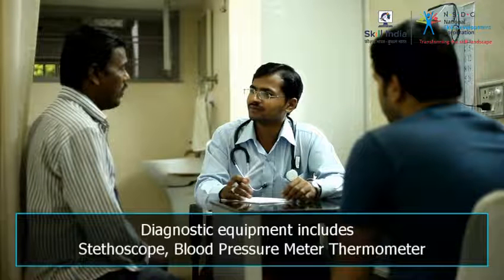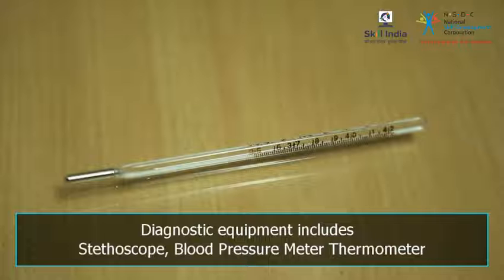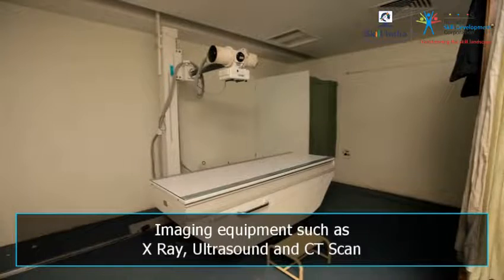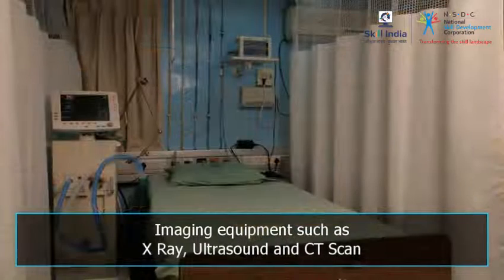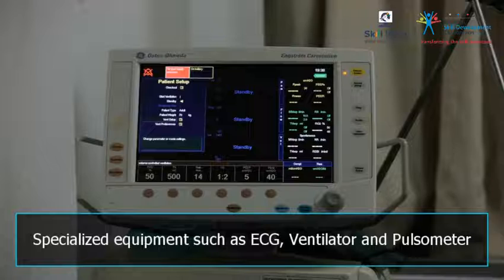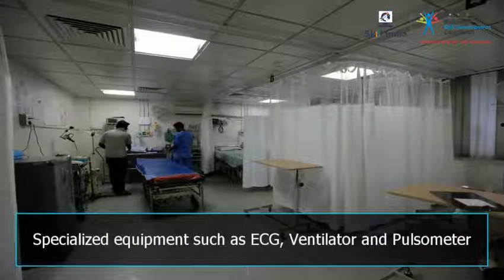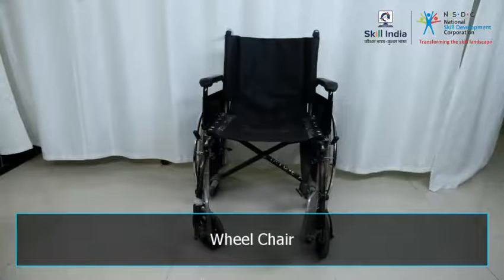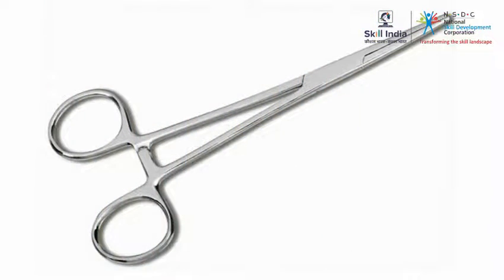The common medical equipment used in the hospital include diagnostic equipment that include stethoscope, blood pressure meter, thermometer, imaging equipment such as X-ray, ultrasound, CT scan, MRI, specialized equipment such as ECG, ventilator, oxygen pulsometer, and other equipment used for patient management such as hospital bed, wheelchair, and stretchers.